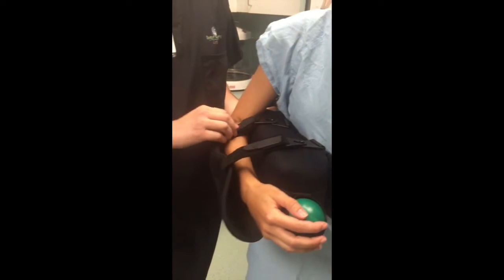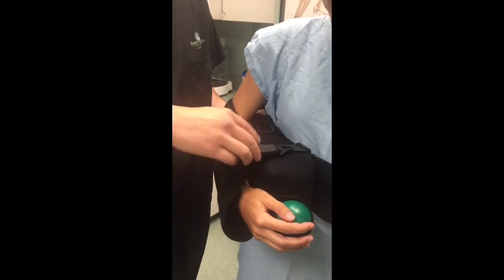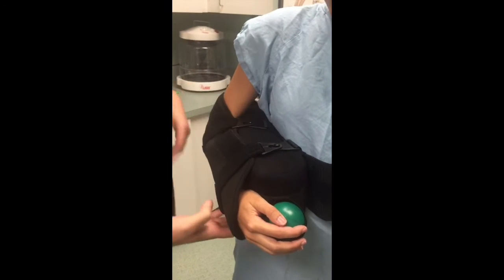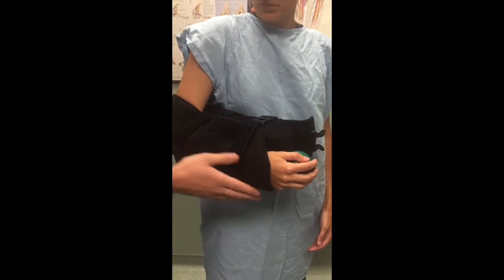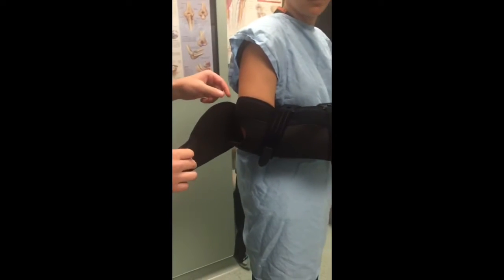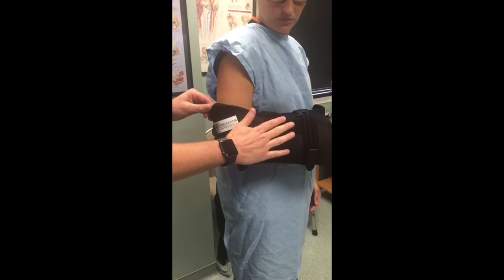Once those are clicked in, you can pull the straps tight using the Velcro. And then again, you want to make sure that this is extended past their wrist so the wrist is snugly fitting into the sleeve. After that part is done, there's a strap back here that's going to secure the elbow into the sling. You can pull that tight over the side and Velcro it right there.